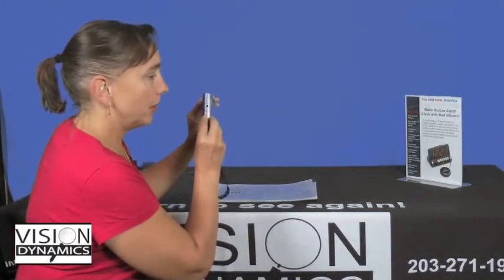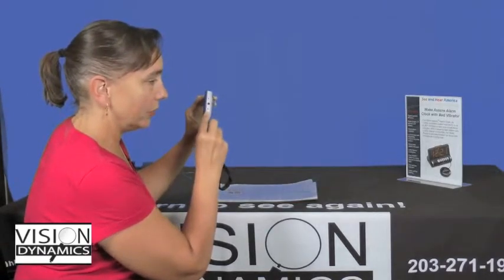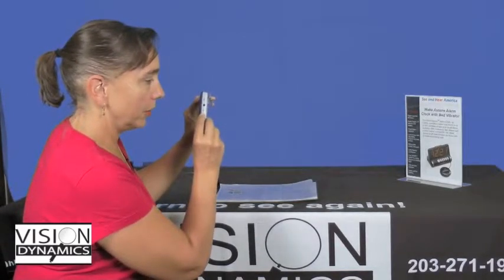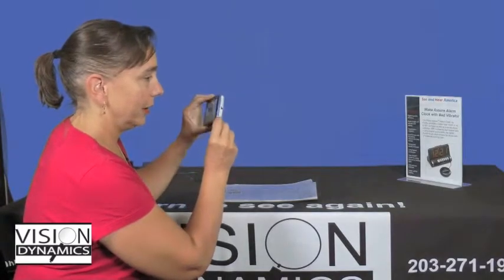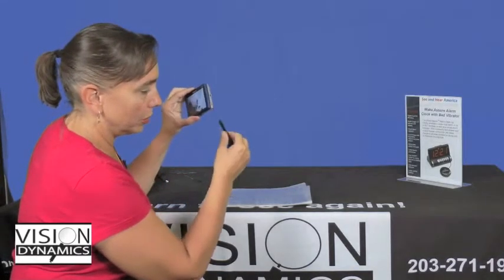So I showed you where the hole is for your charging. Just below that on the edge of the Mini is your on-off button. So you're going to press that, hold it, and it's going to turn on. Now that's where your on-off button is. Then below your on-off button is where you'd hook your wristband in.